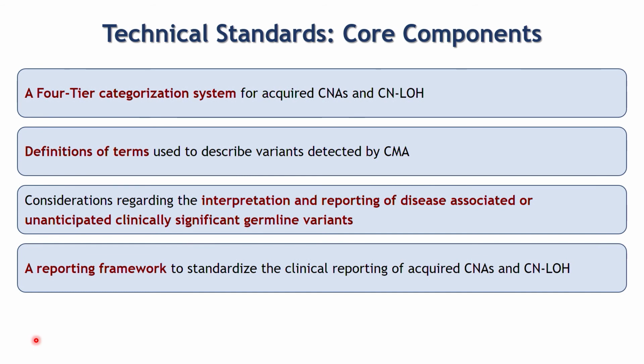We also provide definitions of common terms that are used to describe copy number findings in tumors. This was something that was brought up yesterday during the panel discussion about chromosomal microarray testing in neoplasia. So I want to point out that some definitions of commonly used terms are present in this manuscript. We also describe considerations regarding interpretation and reporting of both disease-associated as well as unanticipated clinically significant germline variants.